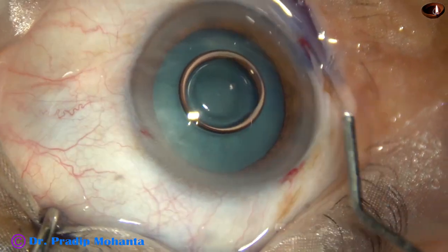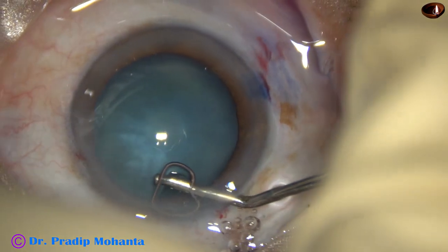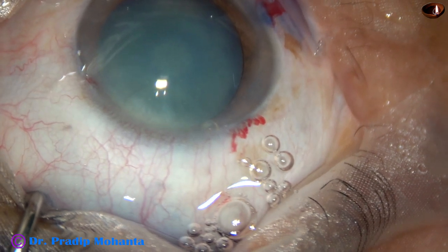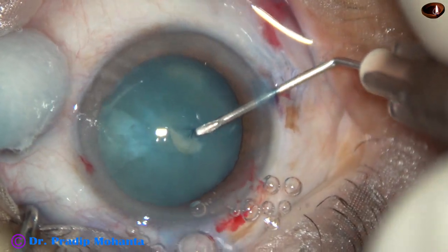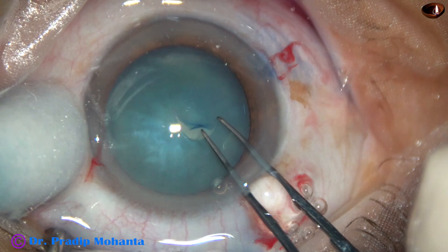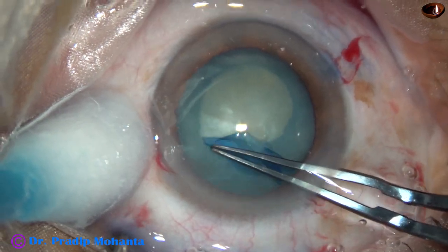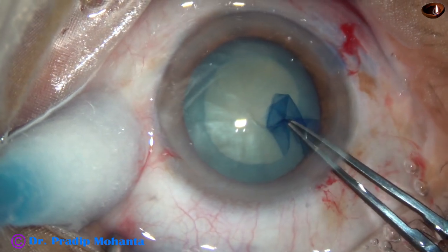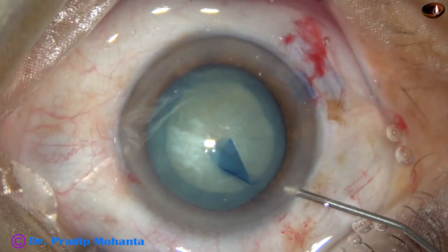Two percent hydroxypropyl methylcellulose is injected into the anterior chamber. This HPMC is being used as OVD. Now capsulorhexis — a 26-gauge bent needle is used to incise the anterior capsule and raise a flap. There is no leakage of any fluid, indicating there is no rise of intralenticular pressure. In such cases we can do an optimum-sized rhexis. Utrata forceps has been used to complete the rhexis. Size of this rhexis is about 5.5 millimeter and it is a fairly acceptable rhexis.